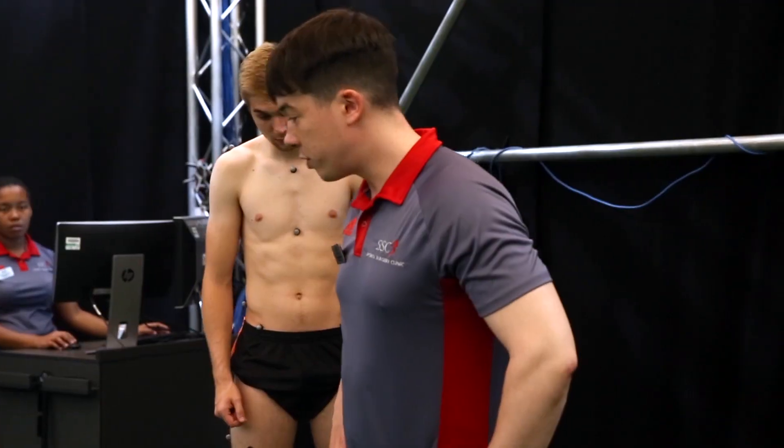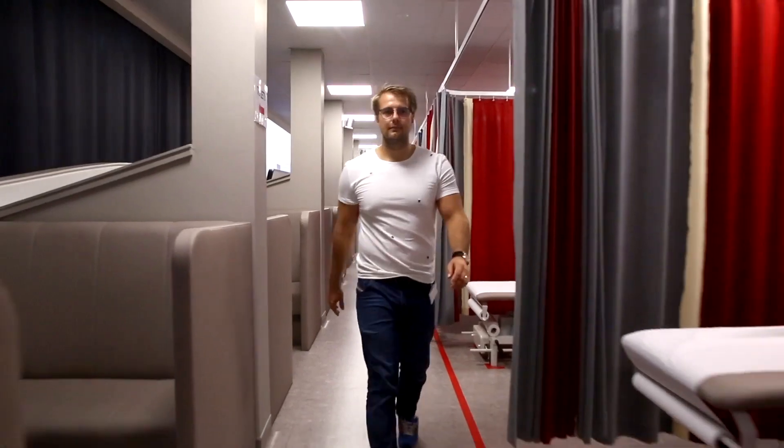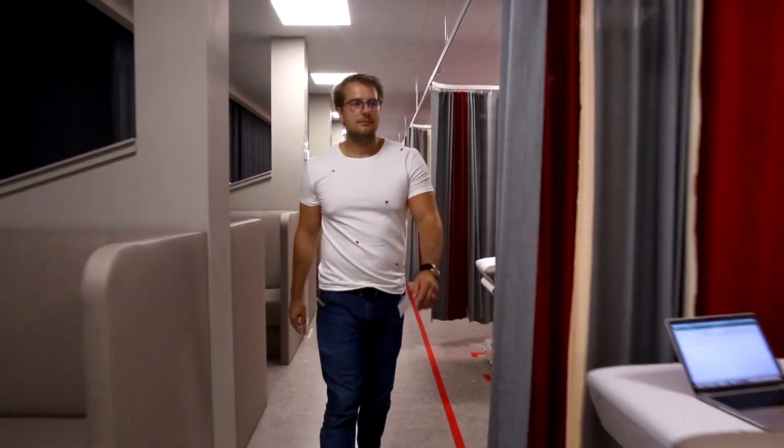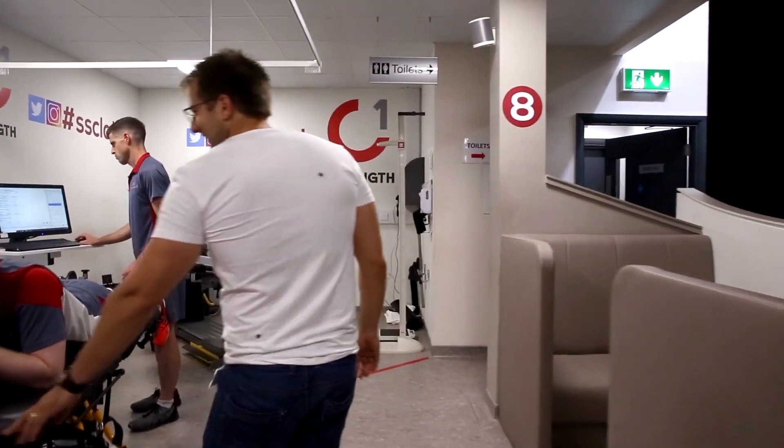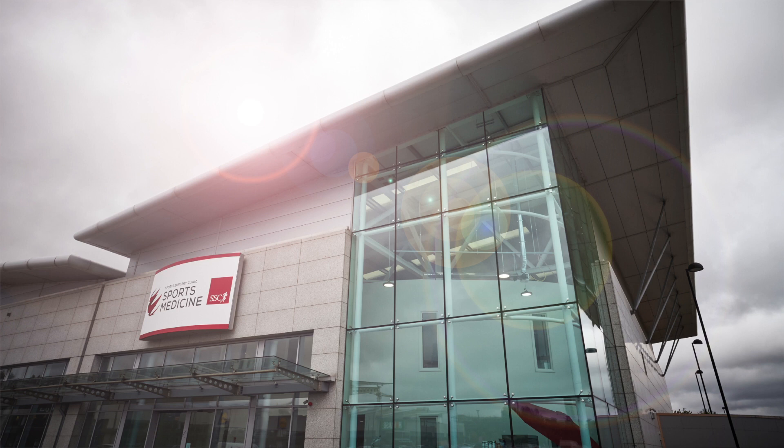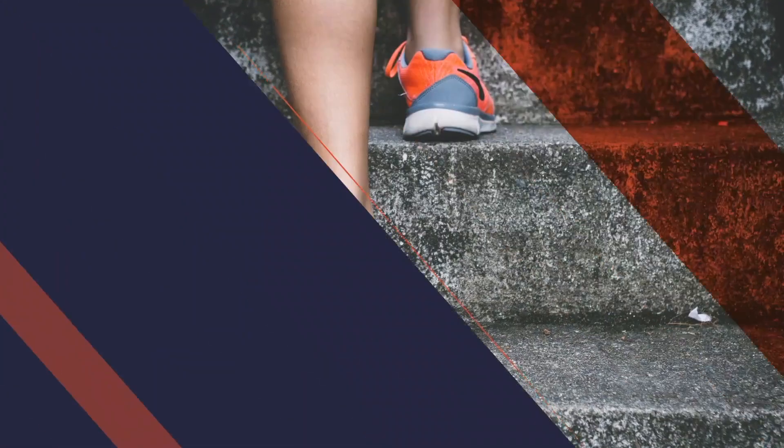The ultimate goal, at least for me, is that we are able to share how important movement analysis can be — that not every patient or every human moves the same way, so every human will need a different intervention. To spread this knowledge across the research community and the sporting community, I think that's the end goal of what we are trying to do.